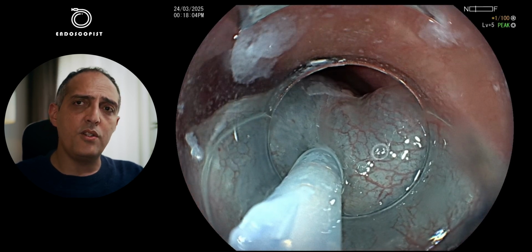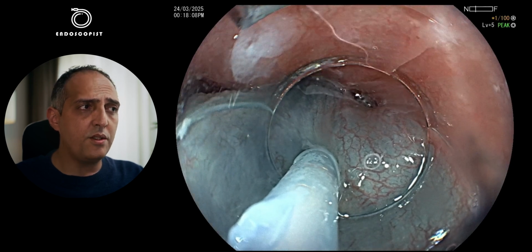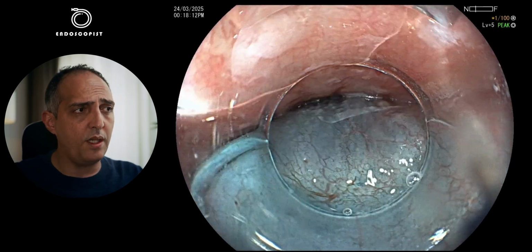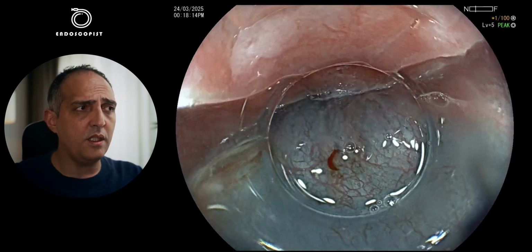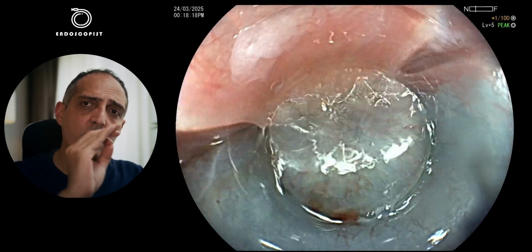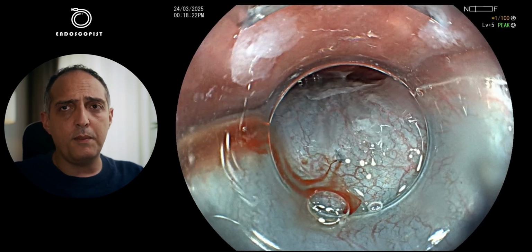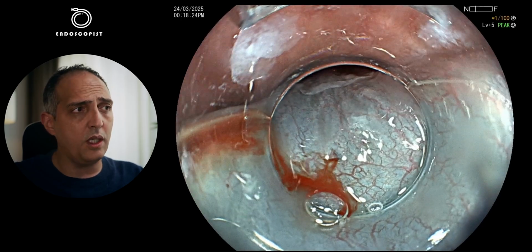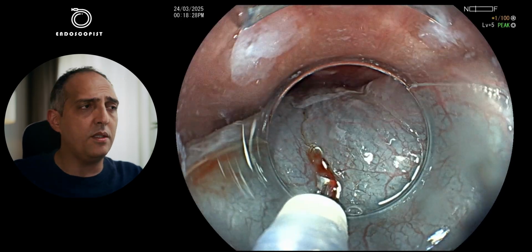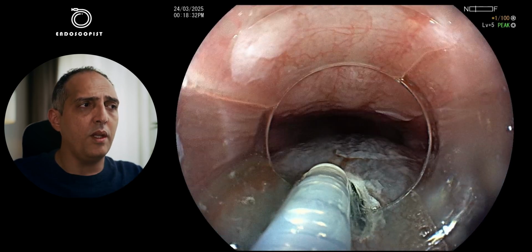Give here a generous amount of injection, at least 4 to 5 milliliters. Try to be parallel to the mucosa, not to injure the muscularis propria at this point, not to do any perforation. So go parallel and then start very gradually to inject. The cardia here was at about 45 centimeters, so I decided to start my incision at 30 centimeters. After the injection, after having good lift, we do the mucosal cut.